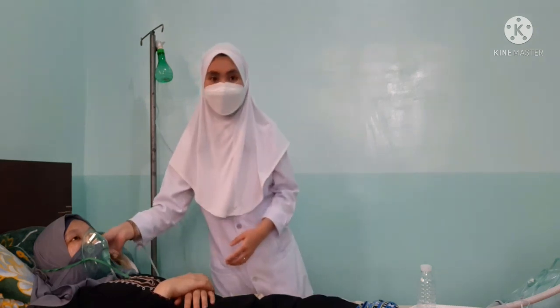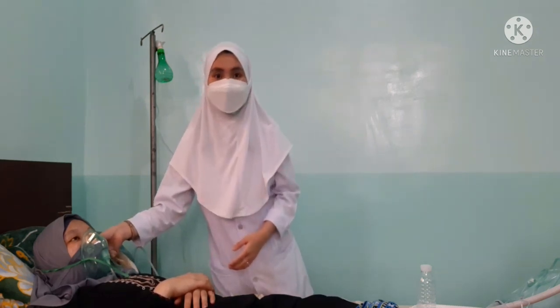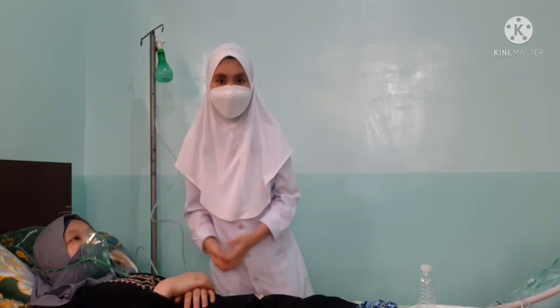Now adjust the size of the face mask or tent to ensure a snug yet comfortable fit. Mist should always be present when using a face tent. This is to facilitate comfort.